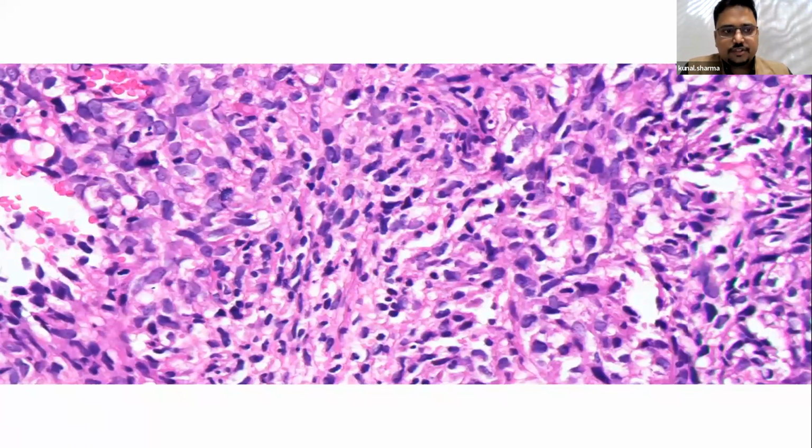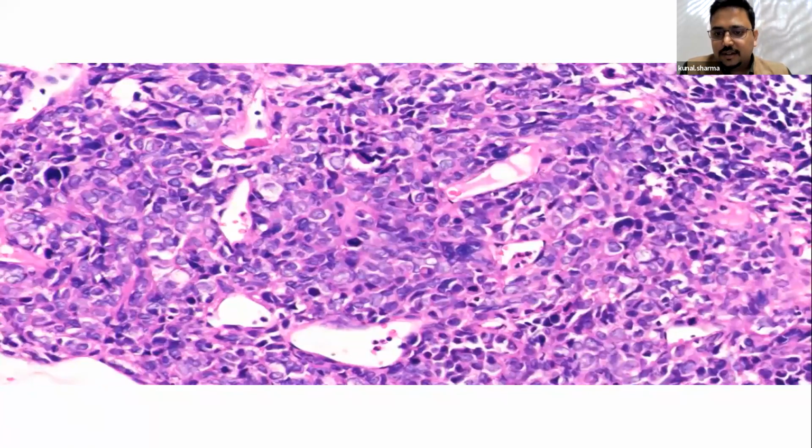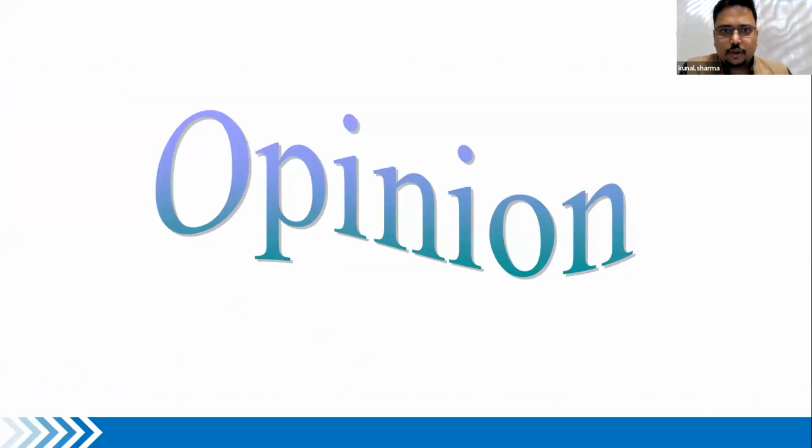There is another thing which was very striking for me in this case. That is what I'm showing here. If there is anybody who can point it out, please feel free to write it in the chat box. But remember this picture and we'll come back to it later. Please feel free to write whatever your differential diagnosis is based on this. Are you open for an epithelial neoplasm, a mesenchymal neoplasm, a hematolymphoid neoplasm, and even a melanoma, an amelanotic melanoma, although we didn't see any melanin pigment deposition? So you can continue to write.